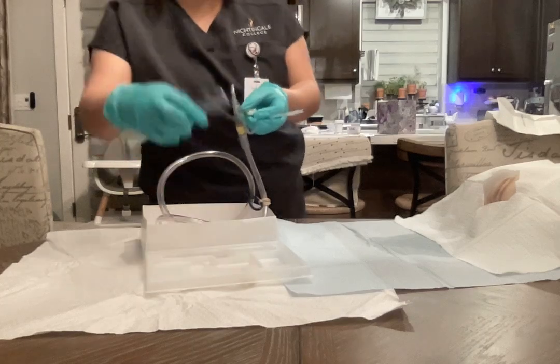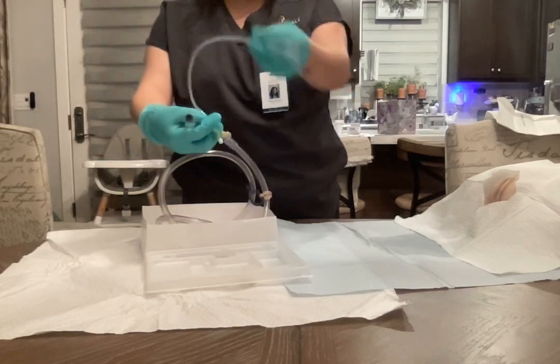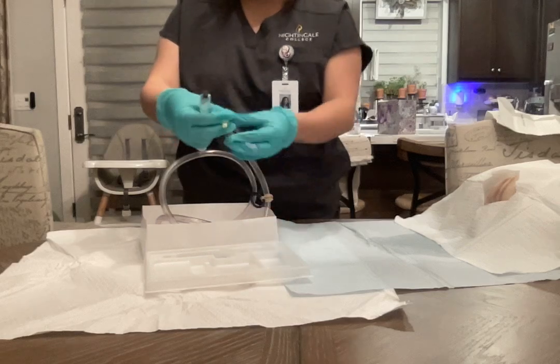Okay, and then attach the syringe. Make sure we have a 10 cc syringe with fluid.